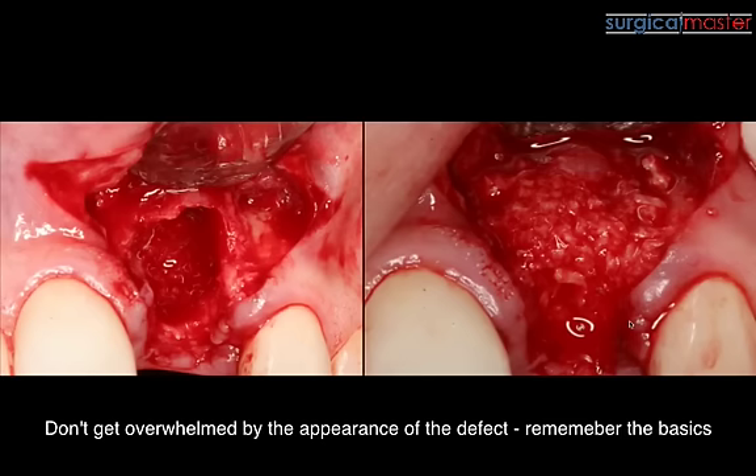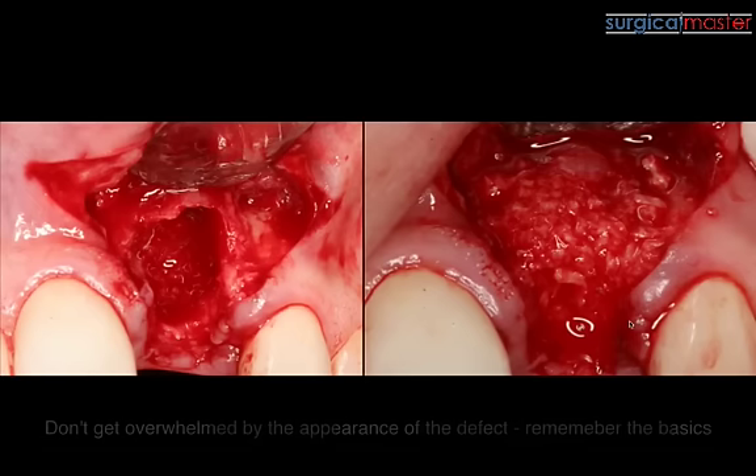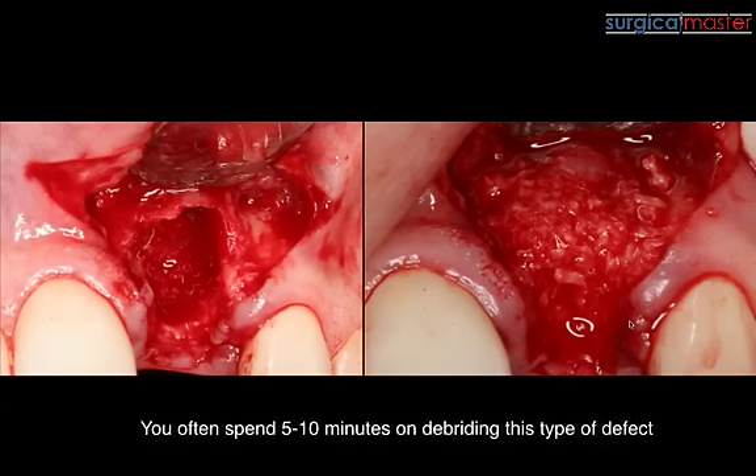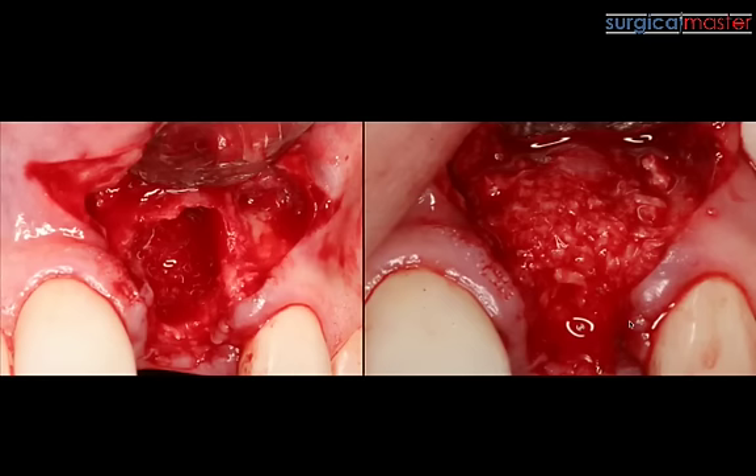Don't get overwhelmed by how it looks. Be very clear, very methodical in your thinking. All it means is that you need to reflect the flap beyond the defect, debride it — spend a good five, sometimes ten minutes to debride the socket, remove all the granulation tissue, and be in contact with the actual healthy bone. If the bone is not very vascular, you may need to create some bleeding points and vascular channels to improve the vascularity.